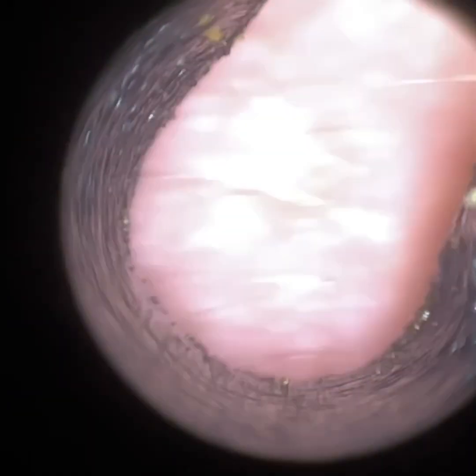It can be quite a difficult thing to do, especially for people that are new to wax removal. Once you've mastered that skill of an endoscope, there's nothing that can really compete in terms of optics, but it can be a bit more tricky.